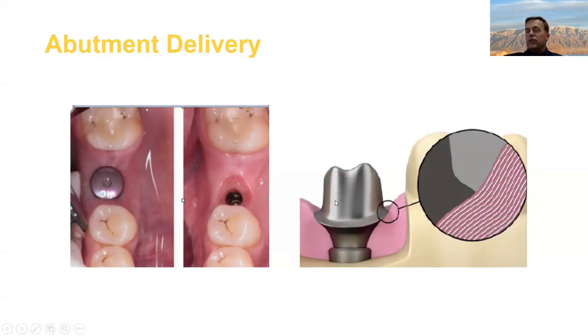One other little trick I would say is that, let's say you get an abutment that fits well, and for whatever reason, you just cannot get the crown down. Sometimes the best way to deal with that is to put some retraction cord here and just take an impression of the abutment. Because, the definition of insanity. We tried to take an impression with an impression coping or scan body or whatever. It didn't work so hot the first time.